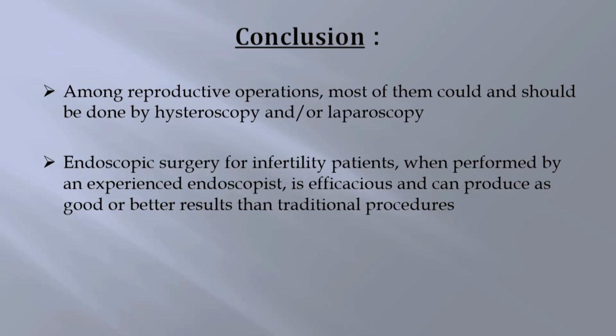So among reproductive operations, most of them could and should be done by hysteroscopy and or laparoscopy. Endoscopic surgery for infertility patients, when performed by an experienced endoscopist, is efficacious and can produce good or better results than traditional procedures. Thank you.